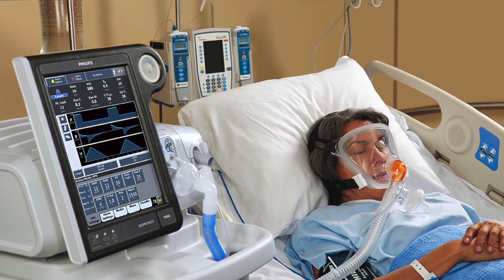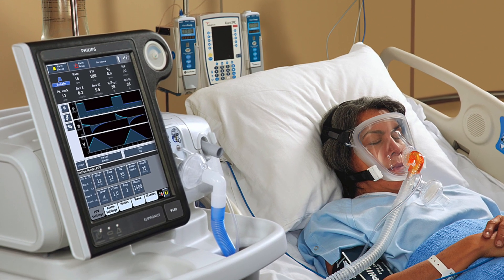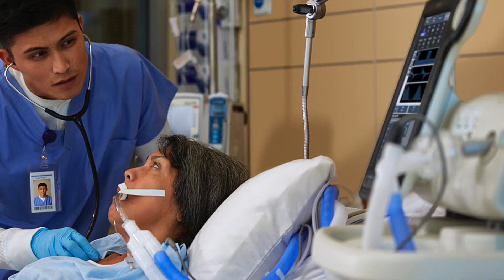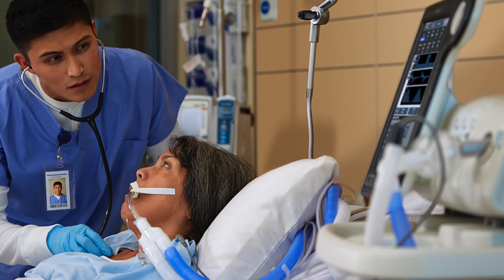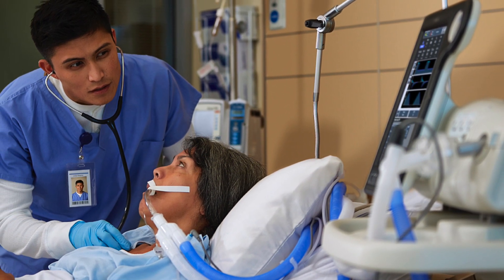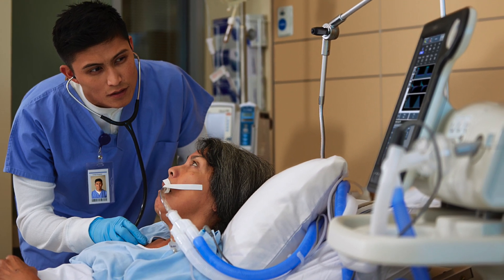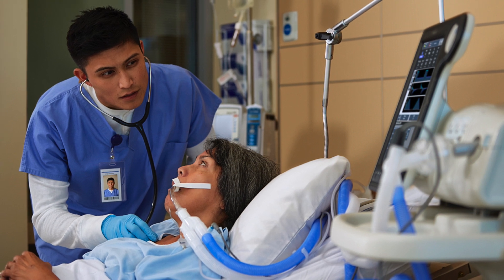We have many years of proven success with this design, and a recent study showed our AutoTrack technology to deliver the highest level of ventilator synchrony. In invasive ventilation, we will set up the ventilator with the traditional dual-limb, closed-circuit configuration, and incorporate an active exhalation valve like you would expect with an ICU ventilator. Before we begin operating the V680, let's take a little tour around the exterior.